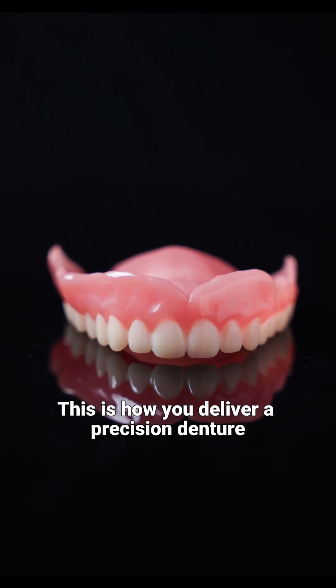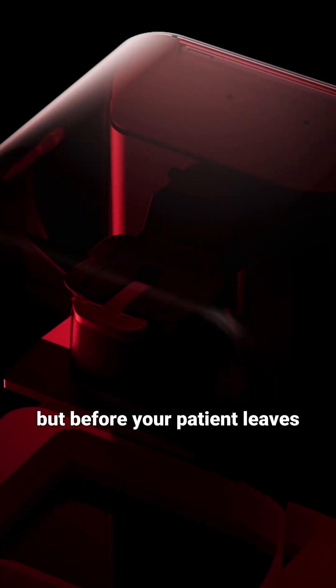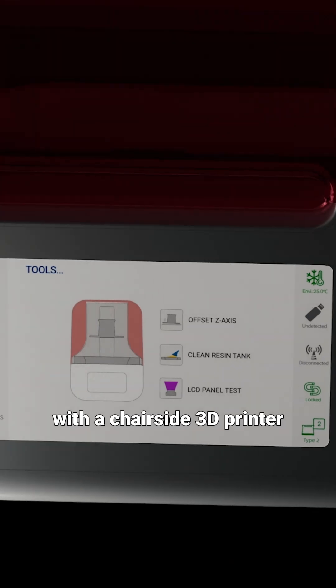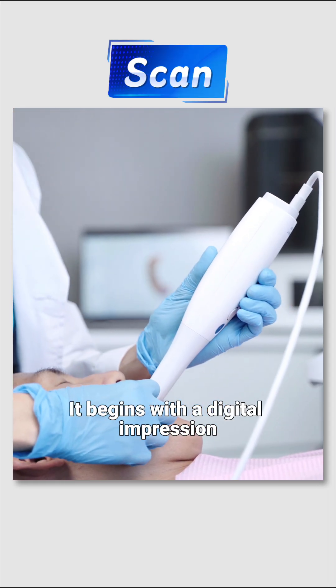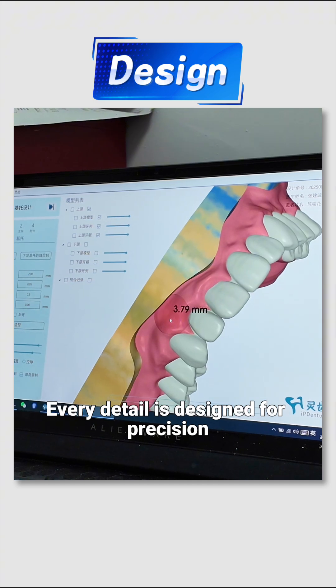This is how you deliver a precision denture — not in weeks, but before your patient leaves, with a chair-side 3D printer. Step 1: Scan and Design. It begins with a digital impression. Every detail is designed for precision.